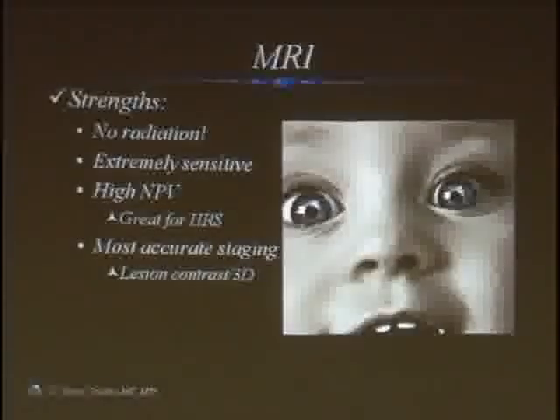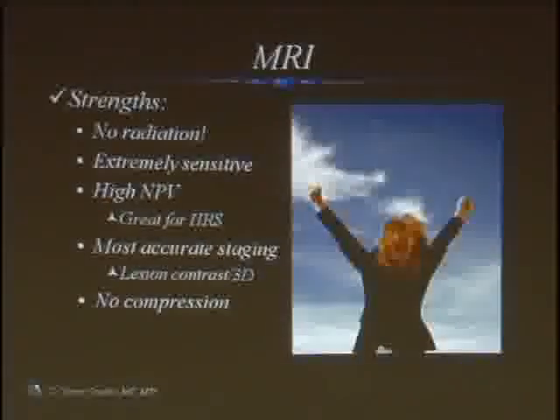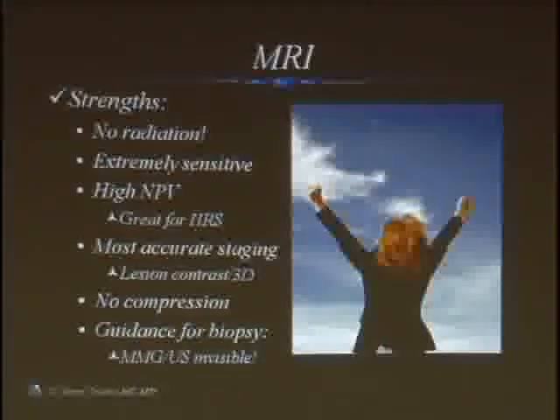Okay? It is the most accurate staging method for known cancer because of its lesion conspicuity and 3D power, and I'm going to show you that in a minute. It uses no compression, which women love. Now, it also provides quasi-real-time guidance for biopsy, even when the lesion is not visible by mammogram or ultrasound. If we see it in MRI, we can biopsy it in MRI most of the time, unless it's right up against the chest wall or right underneath the skin.